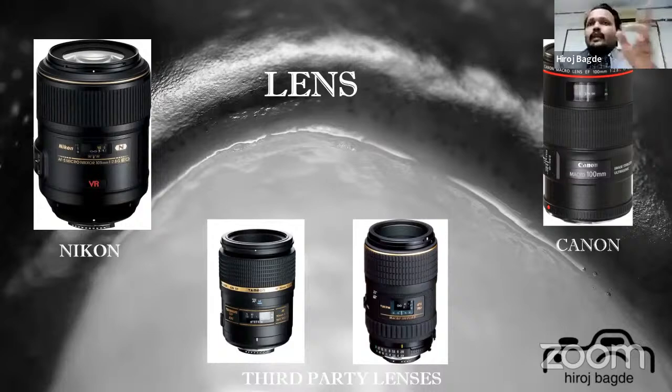That's why a range of 85 mm to 105 or 110 mm is considered apt for a person who is carrying out macro dental photography. It means I have an ample amount of distance between the patient and myself to click.